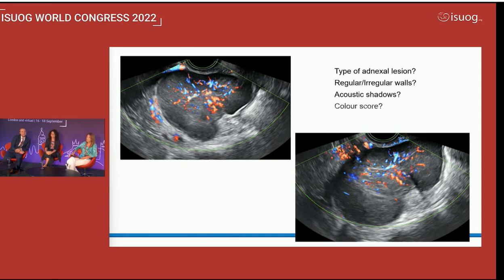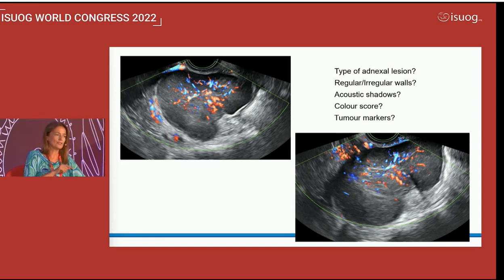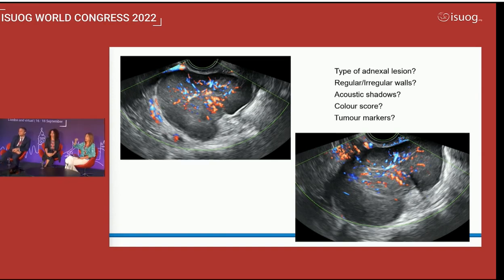So we really... Because of vascularization, I would exclude the fibroma here. Yeah. What do you think? Usually, even if sometimes there is a question over there. Can you go to the microphone for the question?